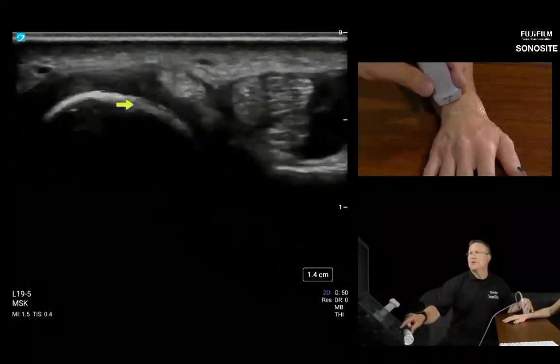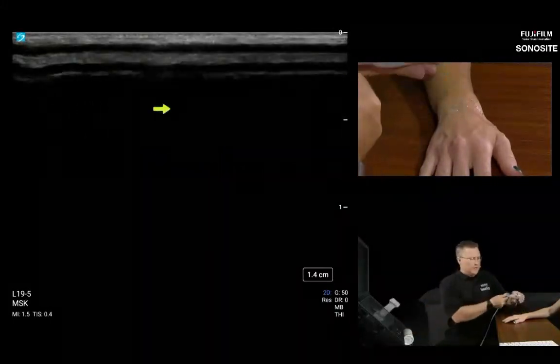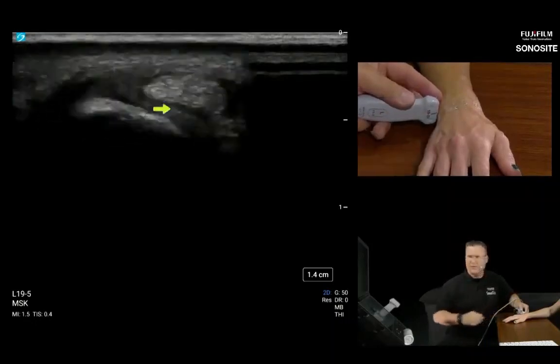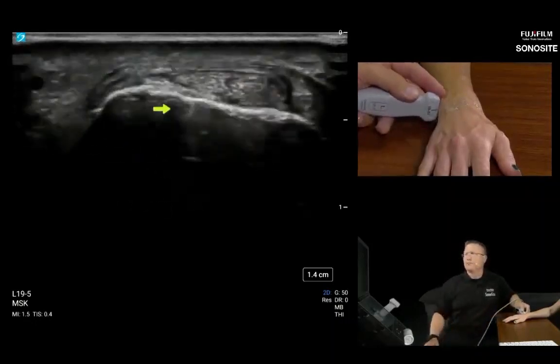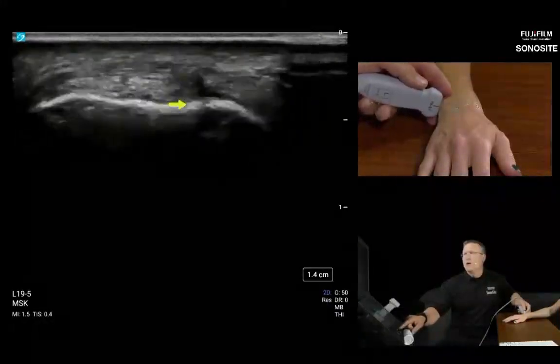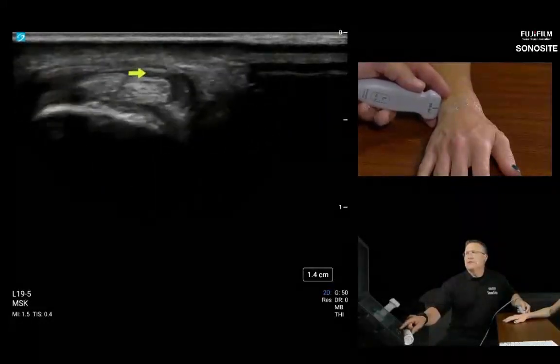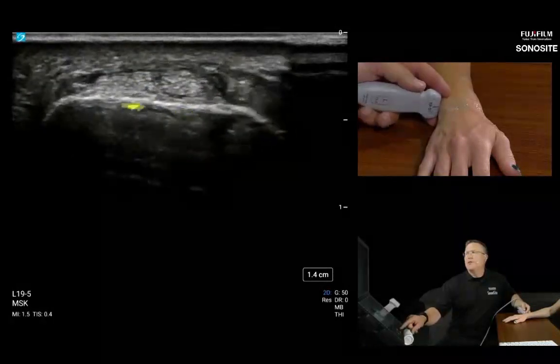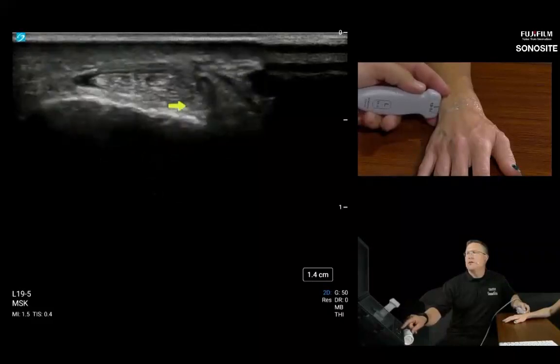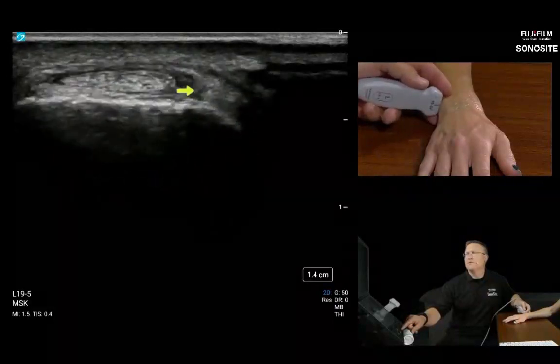And we're going to go back up to the ulna. We're going to wrap the probe around like we did with the larger linear L15. And I'm going to take a little shortcut here. I'm going to aim into the ulna where I'm laying the probe almost to the table. And here we are in the ECU groove. So this groove contains the extensor carpi ulnaris, and it's pinned down by its own retinaculum, and we want to look for those bony prominences. There'll be one on each side. This one is less prominent, so it's more dependent on the retinaculum than the groove.